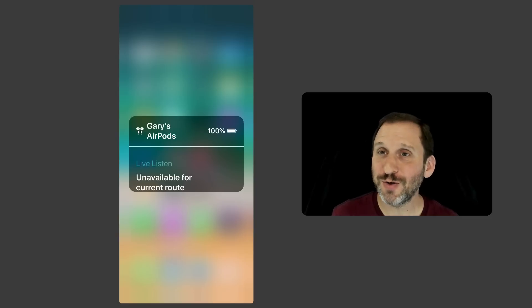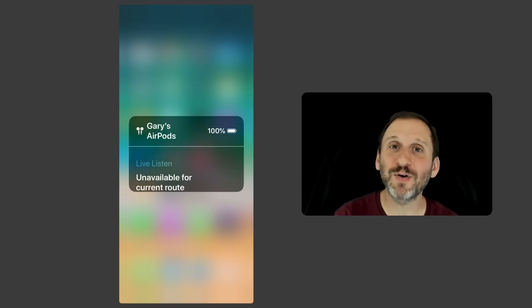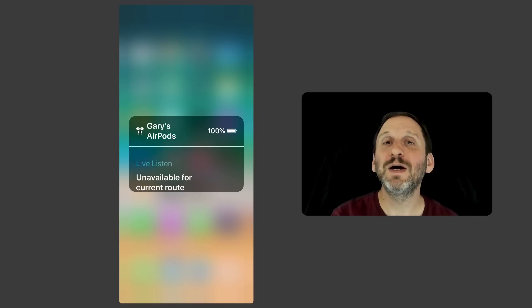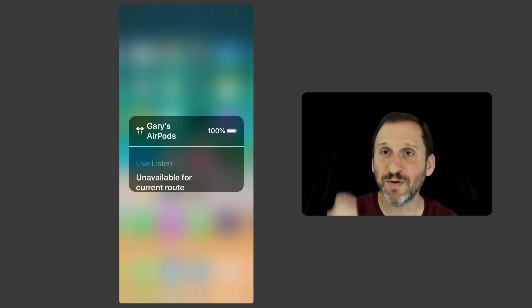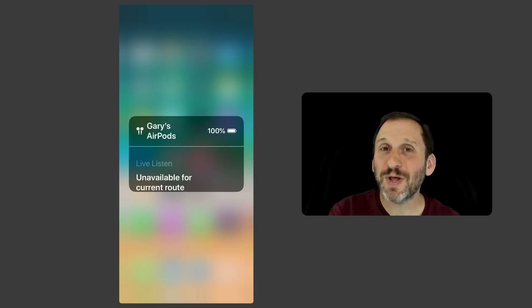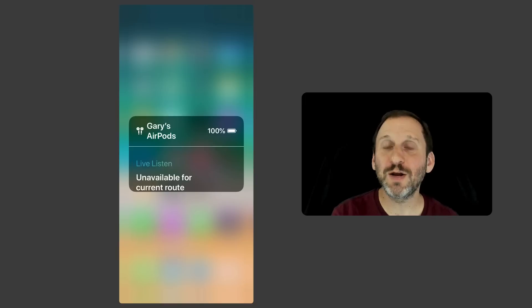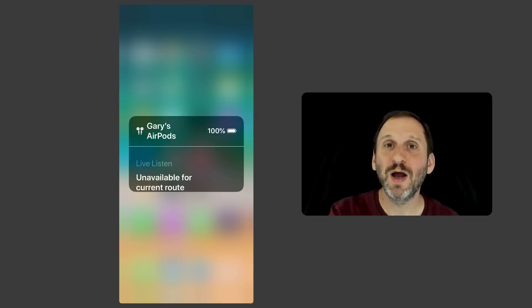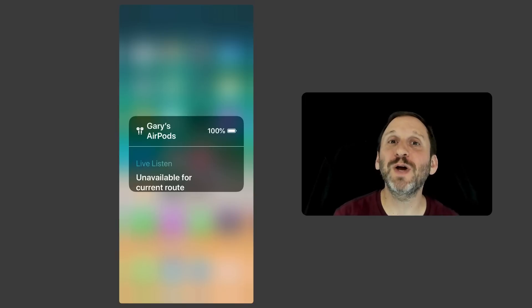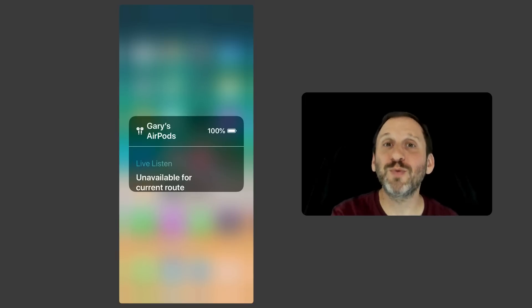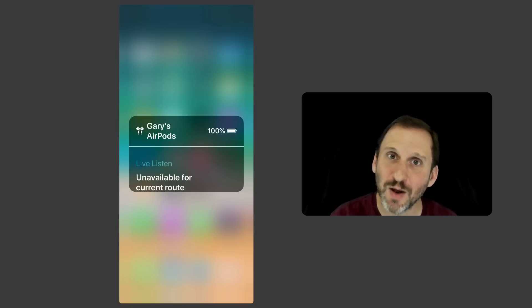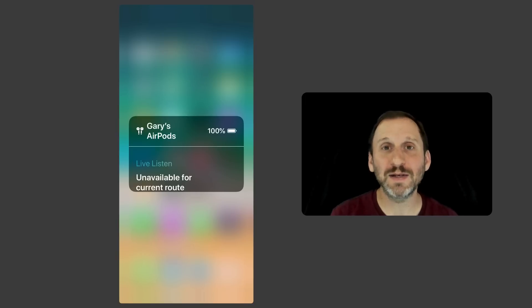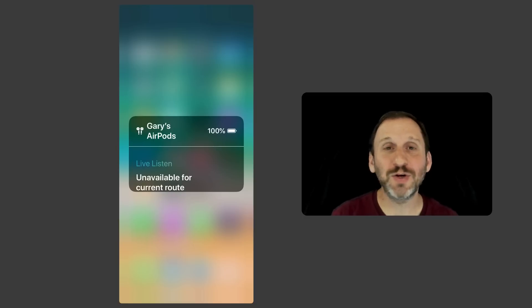You can also use it in some other types of situations because the microphone is actually from your iPhone, not from the AirPods themselves. So you could literally place your iPhone closer to somebody so you can hear them. If somebody is sitting across from you at a table and you can't hear them because it's a noisy restaurant, you can place your iPhone in the middle of the table or even push it closer to them and point the microphone towards them and it will pick up their voice a lot better.